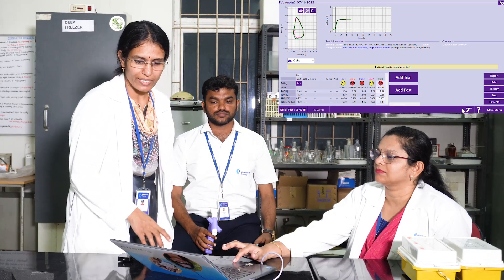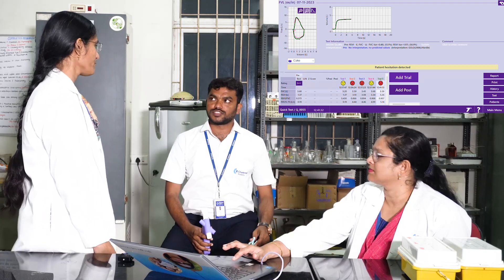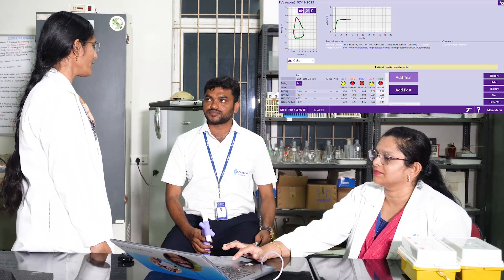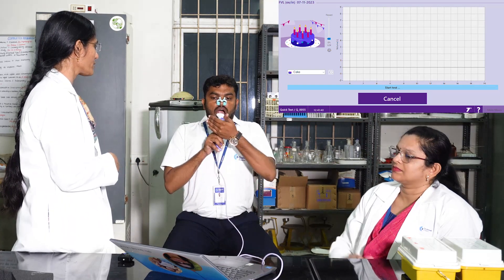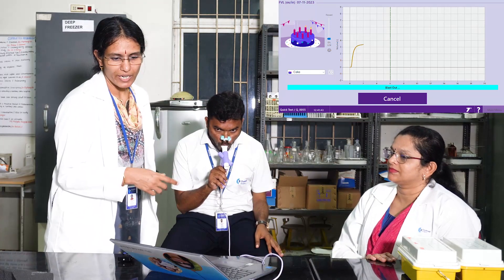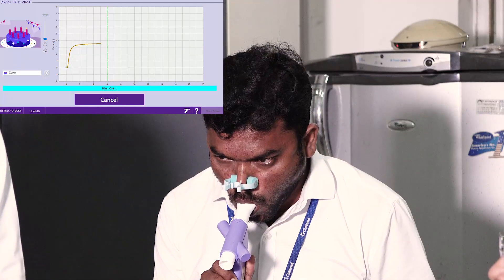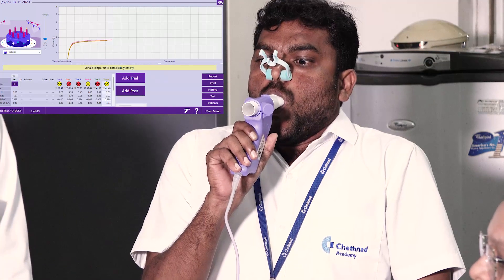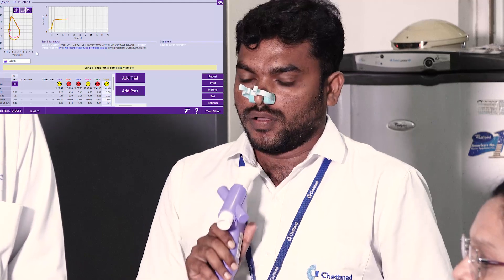Let's do the next trial. Is the subject ready? Shall we start? We have to take a deep inspiration first — hold your breath. Blow through the mouthpiece. It has to be quick. Expiration has to be quick and complete. Now inspire through the mouthpiece. This is the second trial.